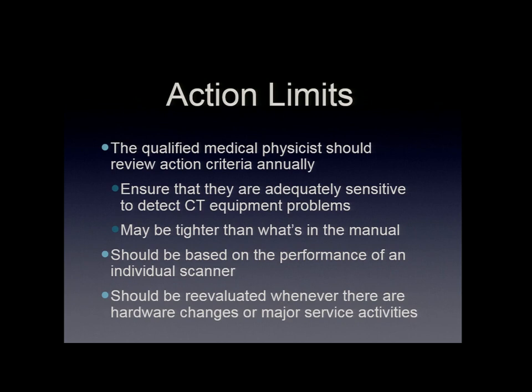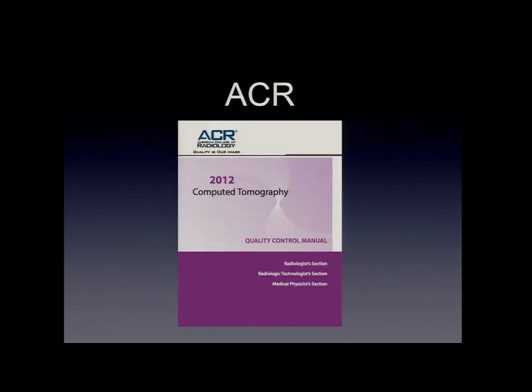There may be a need to make sure that the tube is giving the same output, and therefore your CTDI information is still valid, because there are differences in outputs from different manufacturers that can affect that.